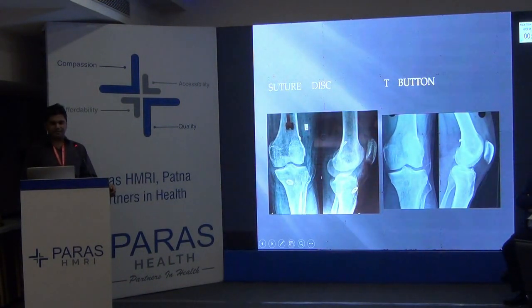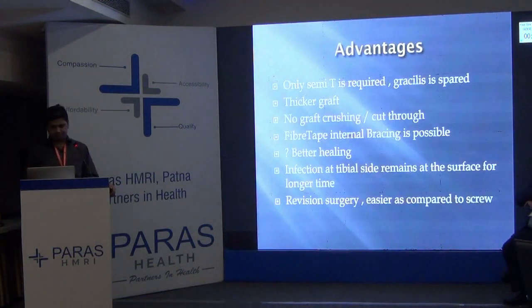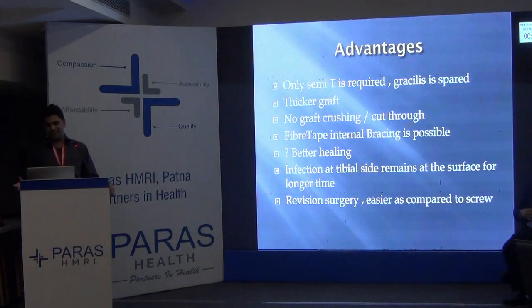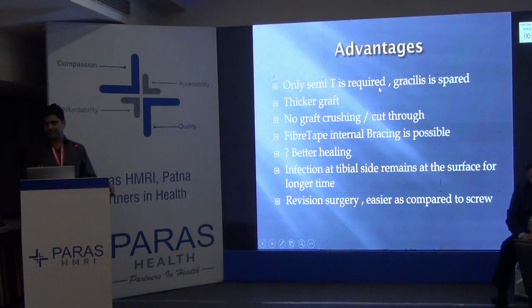This is how the X-ray looks in suture disc, and this is how it looks in T-button. The rehab is the same as aperture fixation. The advantage which I feel we get with surface fixation is only semitendinosus is required and gracilis is spared.